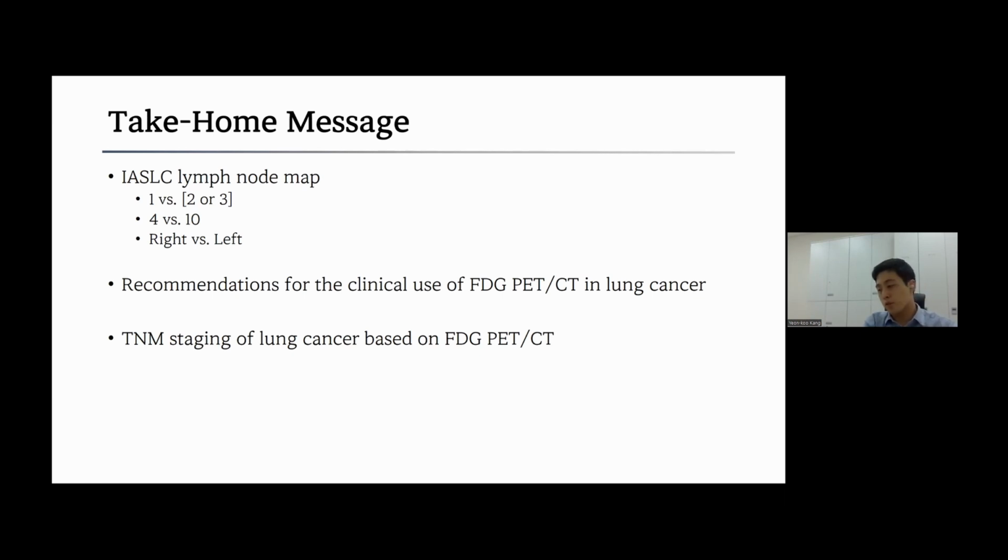So we should take a very comprehensive and closer look at the patient history and a lot of possible information we can get from the medical history and CT findings, and then we should determine.